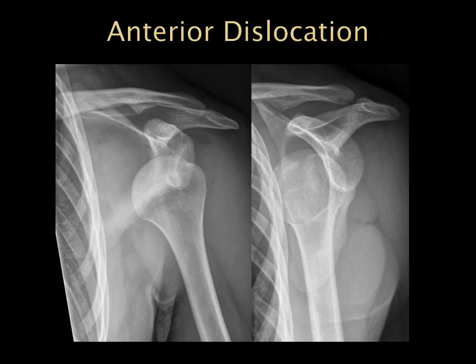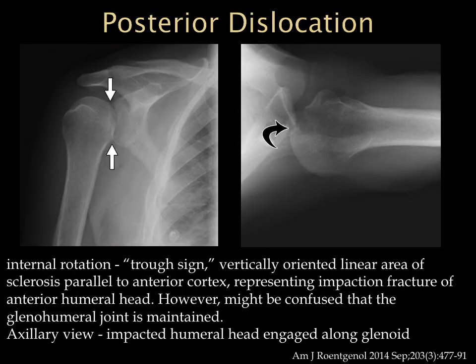One of our more common injuries in both pediatrics and adults is anterior dislocation, which you can see on frontal and transcapular views. A little harder to diagnose is posterior dislocation. On the frontal view, we see internal rotation and what's called the trough sign — a vertically oriented linear sclerosis paralleling the anterior cortex from an impaction injury. On the frontal view alone you might not pick up the actual dislocation, whereas on the axillary view we can see the impacted humeral head engaged along the glenoid posteriorly.